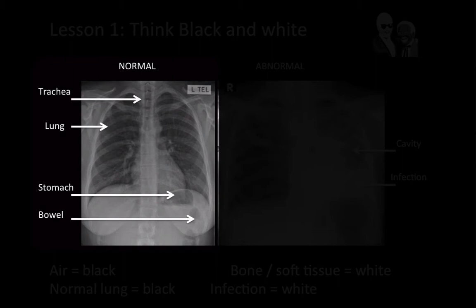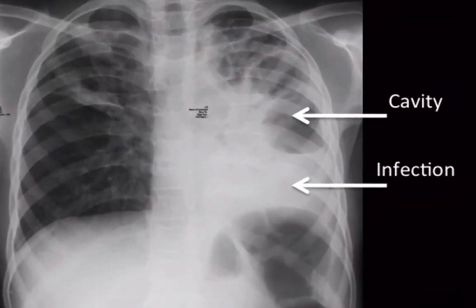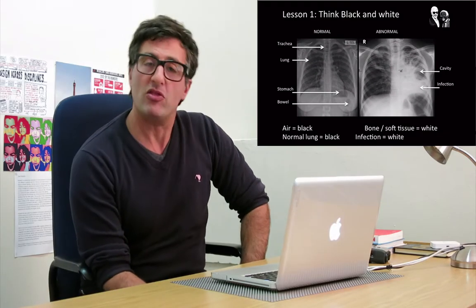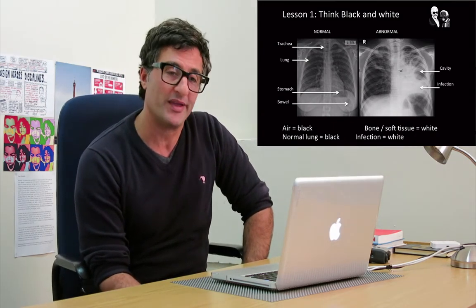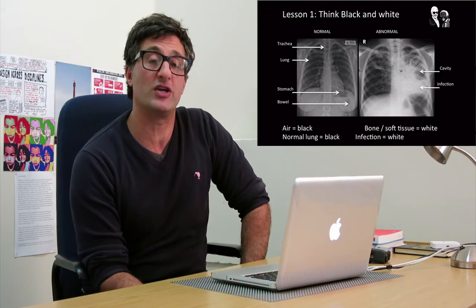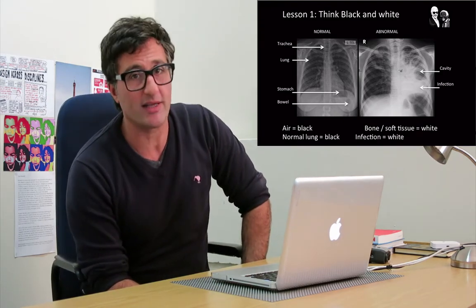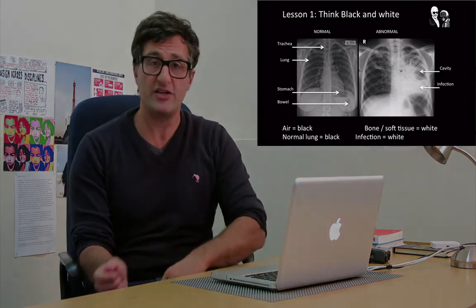Keep in mind that a normal healthy lung should be full of air and should be black, because the x-ray is usually taken with the patient having inspired. An abnormal chest x-ray demonstrates left-sided disease in the lower portion of the lung — that area has all become white. In the center, a cavity appears which contains air and is once again black. It's simplest to expect the lung to be black, and once it's white, it's abnormal.